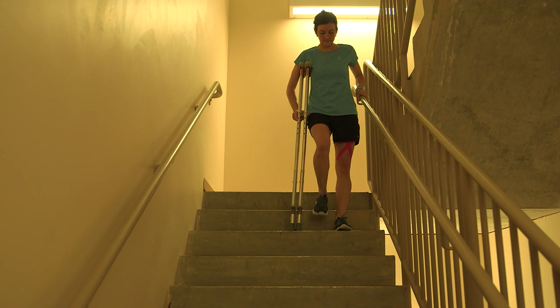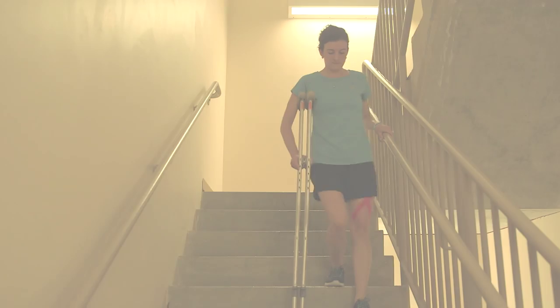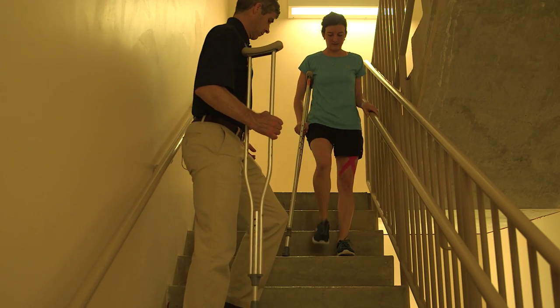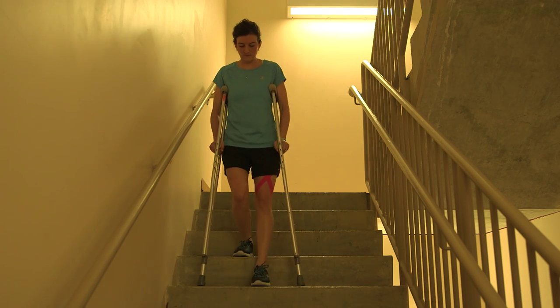To go down the stairs, bring your surgical leg and the crutches down first. You may use a handrail if available. Either give a crutch to a friend or place both crutches together under your arm. Or you can use a crutch under each arm without using a handrail if none is available.